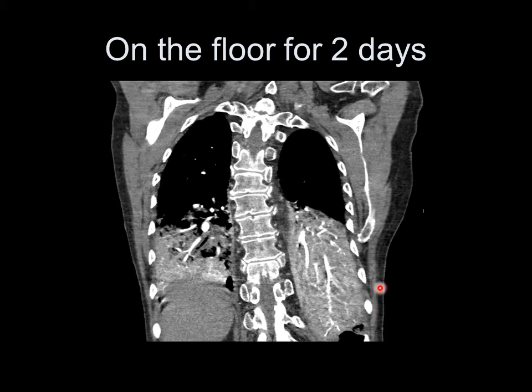But if you look at this patient here, you can see that there's still extensive airspace opacification, but very few air bronchograms present here. Now, I'm not quite sure what the explanation is for this. I don't think this was actually consolidation in the true sense, because the patient was promptly discharged, and if this was infection, it would have been very extensive. It would be unusual to have such severe bilateral pneumonia. I think this is a form of atelectasis, but I'm not quite sure of the explanation for this appearance, and I think perhaps these findings have to be judged in the clinical context.